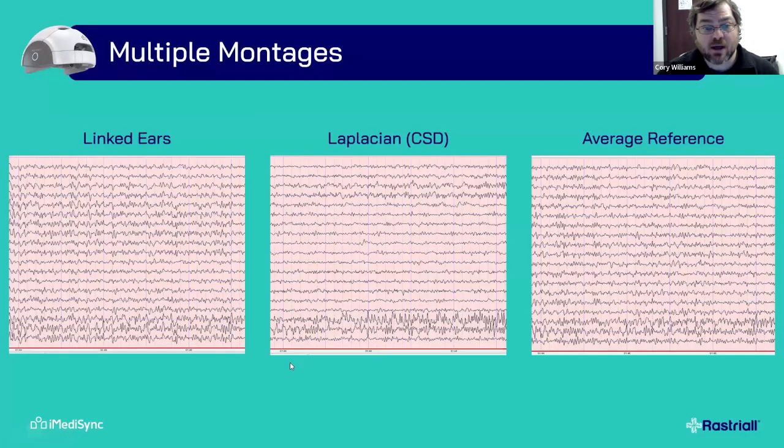Like I said, we can look at different montages. So this is the same brain, the same time signature in 3 different montages. And each one gives you different information. Now, we don't need to get into the specifics of why one versus the other. I mean, this is a class in and of itself, but just know that there are different ways that we can organize the data, and each way that we organize it shows us a little bit more information, tells us a little bit more about the brain. And that's what we want. That's why we do these assessments, so that we can learn as much as we can about how our client's brain is functioning.